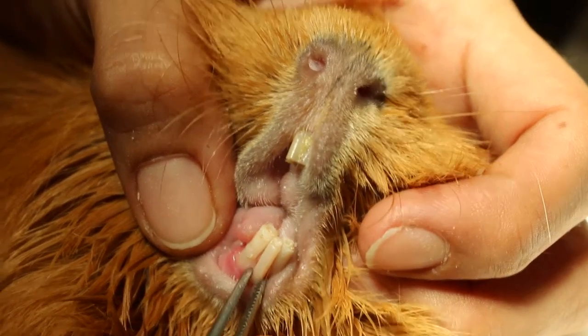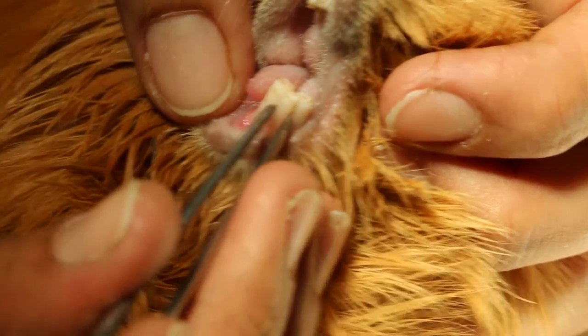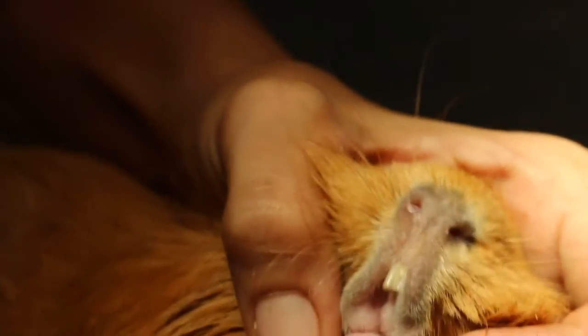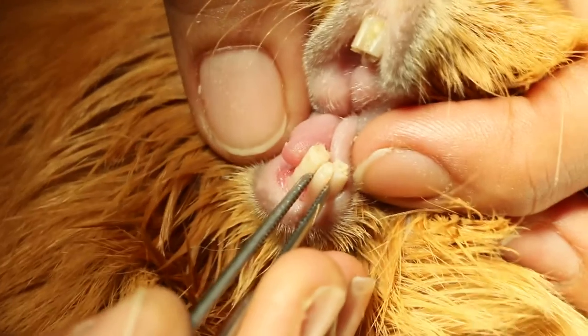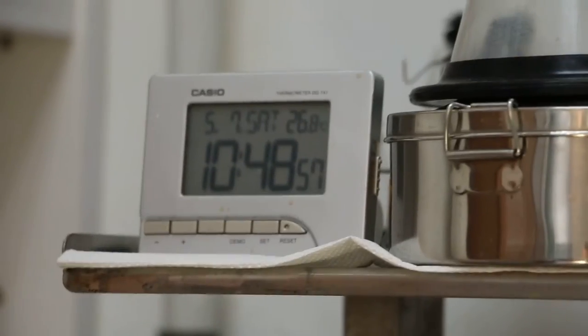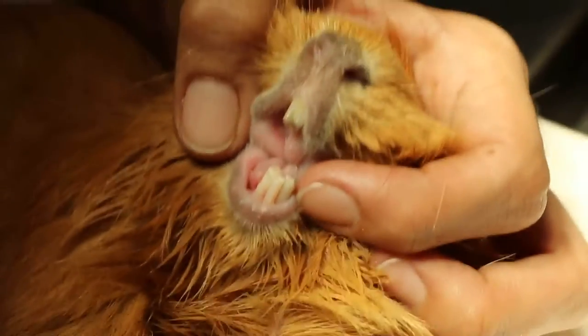So I told the owner the best is to extract it later on when the kidney case is healthy. That is how we use the Dremel Burr to clip the teeth without fracturing it. You can see the teeth are not fractured along the length, as would happen if we used a cutter. The guinea pig is okay so far. It takes quite a long time because the teeth of this 4-year-old guinea pig are quite broad and thick, as you can see.